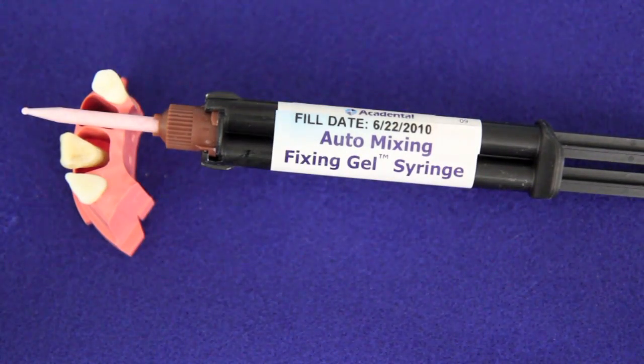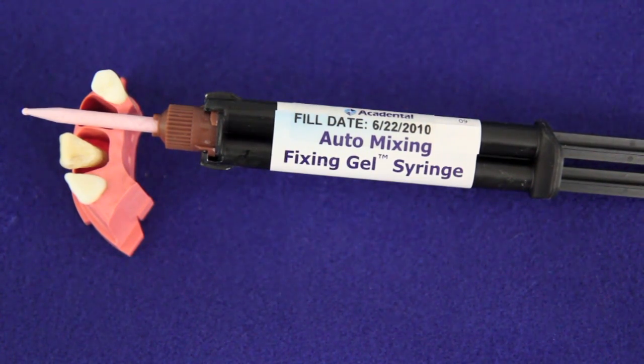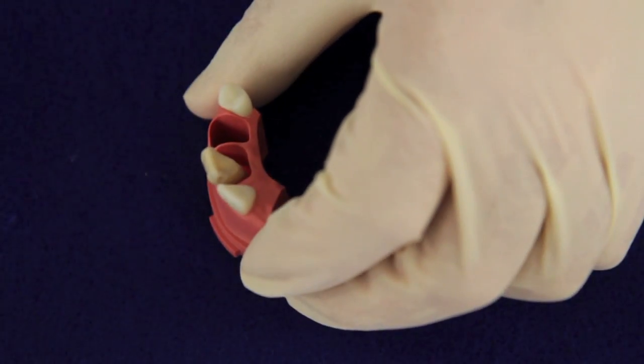Now we're going to use fixing gel to secure the tooth within the segment. The fixing gel is very like a flowable composite. Its handling properties are a bit like that of light body impression material. We're going to try and keep the tip within the body of the material, and we're going to try and keep the tip moving as we apply the gel inside the segment.